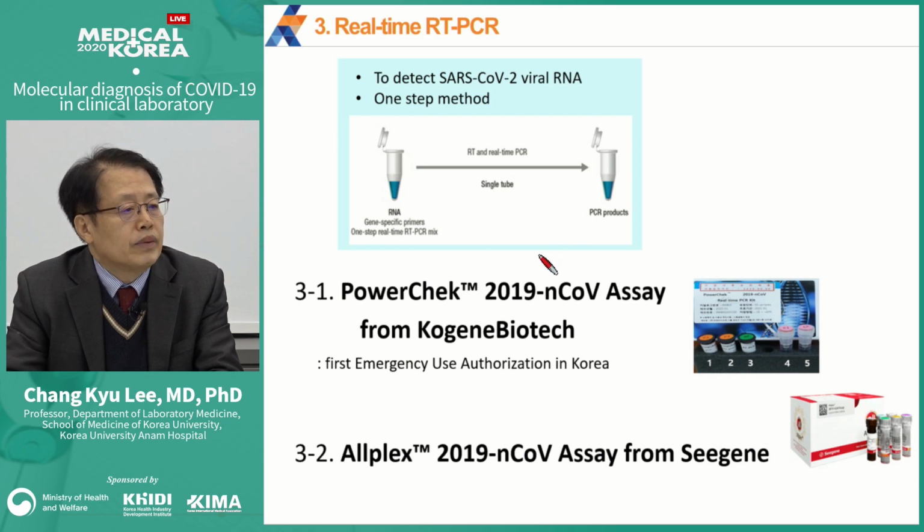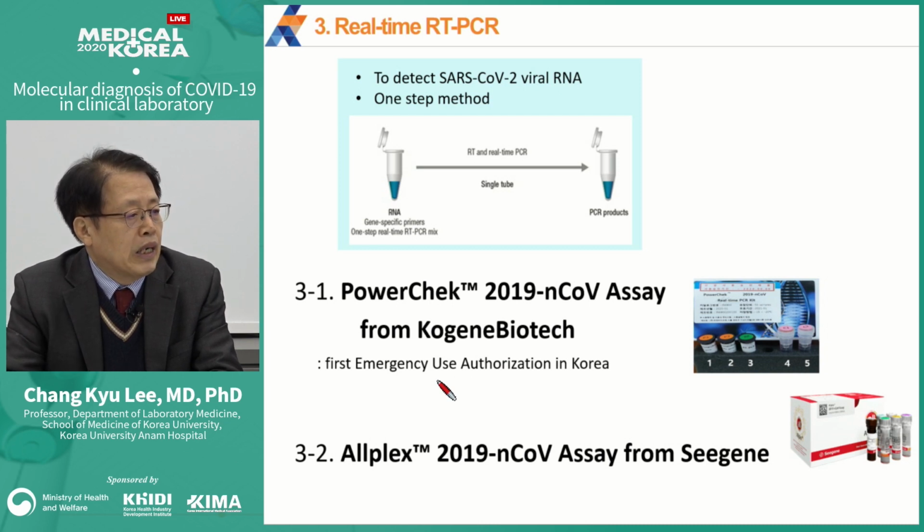We have used 2 products made in Korea. One is PowerCheck from Kogene Biotech. It received first emergency use authorization in Korea.